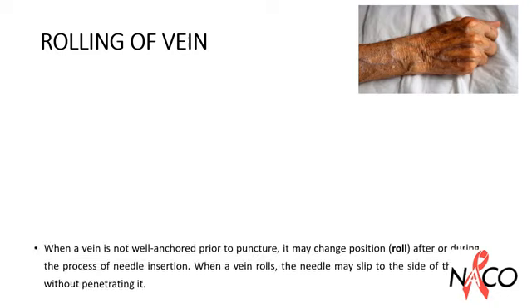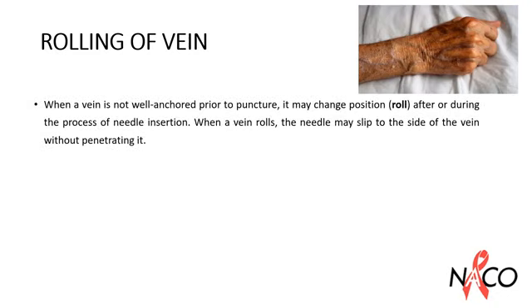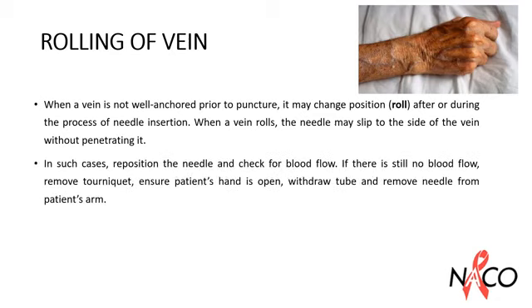Rolling of the vein. When a vein is not well anchored prior to puncture, it may change position or roll after or during the process of needle insertion. When a vein rolls, the needle may slip to the side of the vein without even penetrating it. Reposition the needle in such cases and check for blood flow.